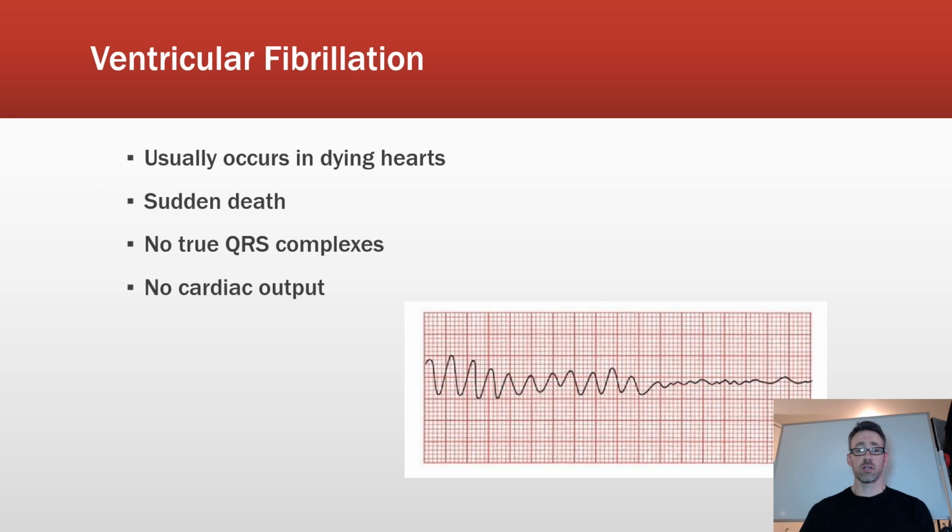Now in ventricular fibrillation, this typically occurs in dying hearts. So these are very sick hearts. This could be one of the reasons for sudden death. There's no true QRS complexes. There's no cardiac output. The patient's not responsive.